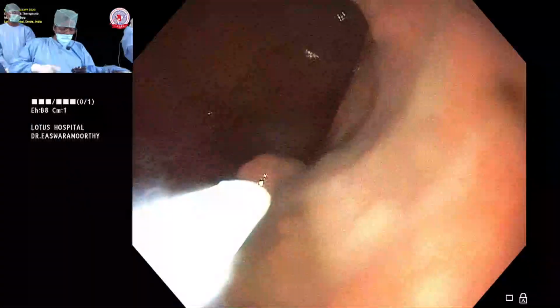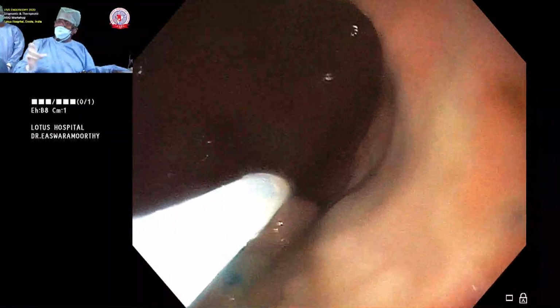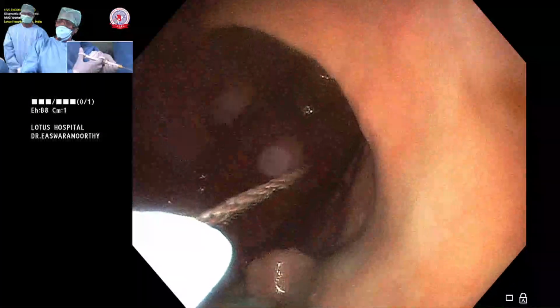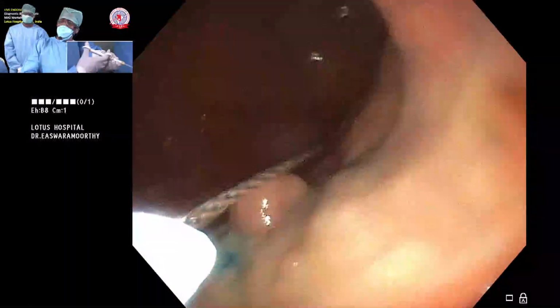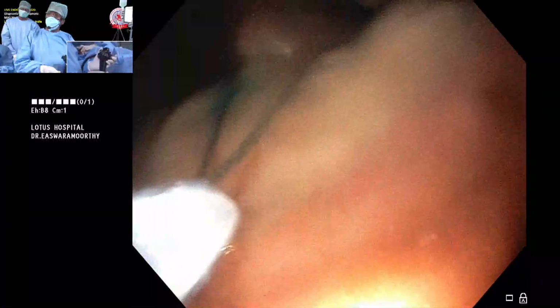And also, you watch me. I'll show you that particular technique. You open enough, full open, pause, open. So she is opening a little bit more. Yeah, a little bit more. Yes. She opened a little bit more. Yeah. See how I engaged it. See, you watch me, this hand. I am actually keeping my big wheel away from me. See, when I put it, this is the normal wheel, I bring the big wheel away from me, and it settles down on the floor. Then she closes.